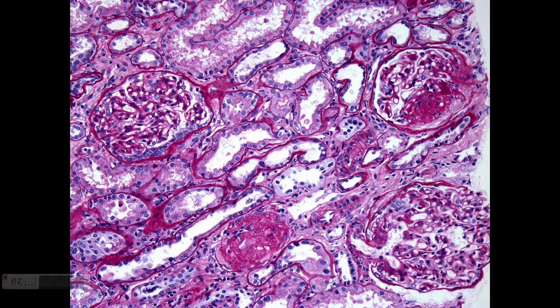Focal and segmental sclerosis is a pattern of glomerular injury that we see by light microscopy, when some glomeruli are globally sclerosed, like for example here, or others are segmentally sclerosed, like for example here. So, as you can imagine, a number of different conditions and diseases can lead to this pattern of injury.